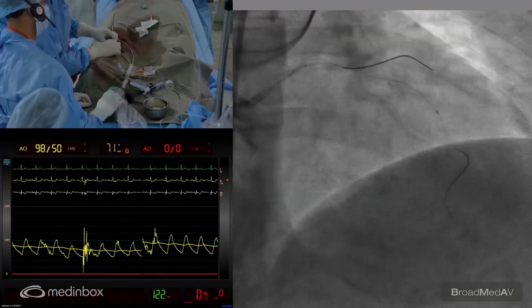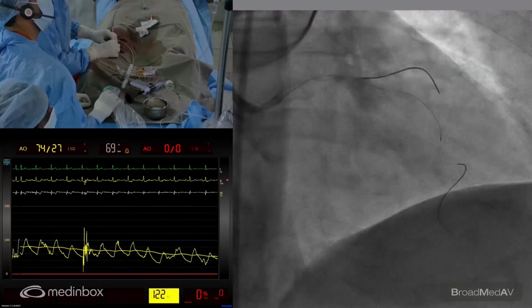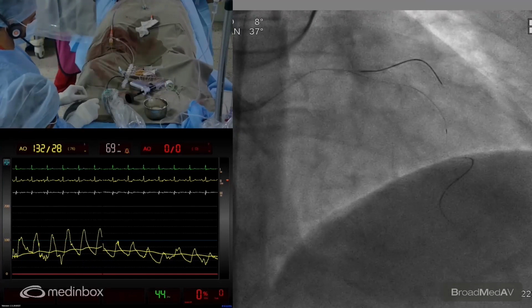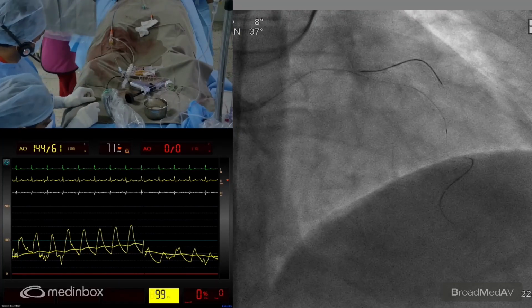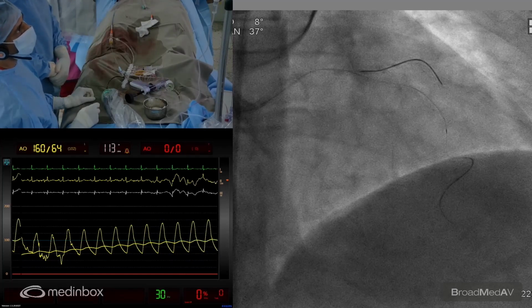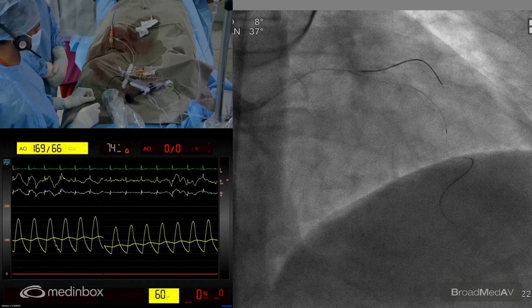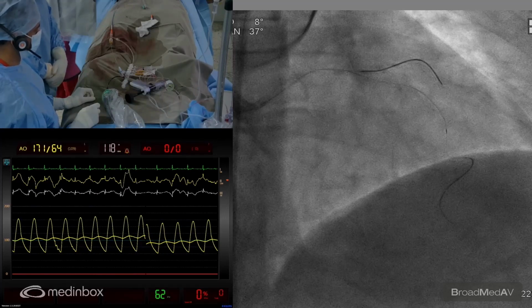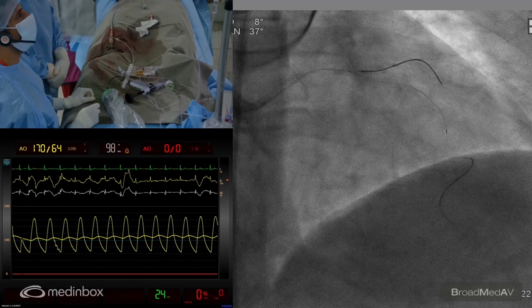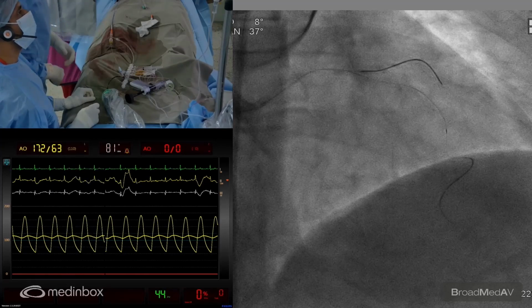So now I'm going to change the direction of the catheter. Sir, we'll allow some pressure drop a little bit. Coronary perfusion. Pressures are dropping. Okay, I'm just pulling the catheter out and letting it have a drink. So it's very important in these left mains to do this very slowly and do it comfortably rather than in a hurry. So we have now given 2 shots. I think this may be good enough, but let me see what we can do once more. And then we'll have a full cycle of 10 and then have an IVUS look, okay?